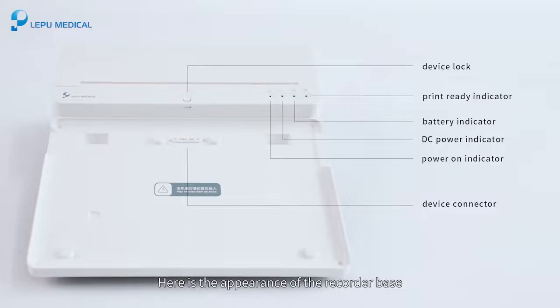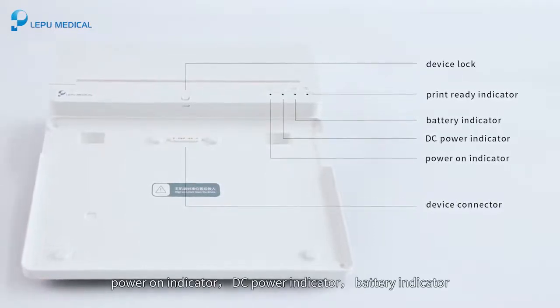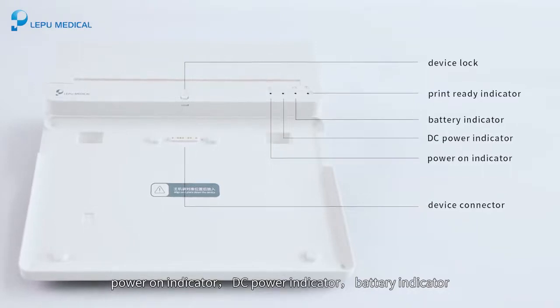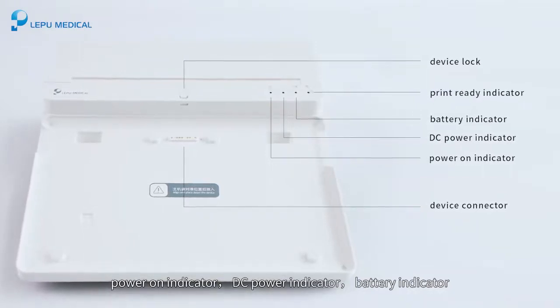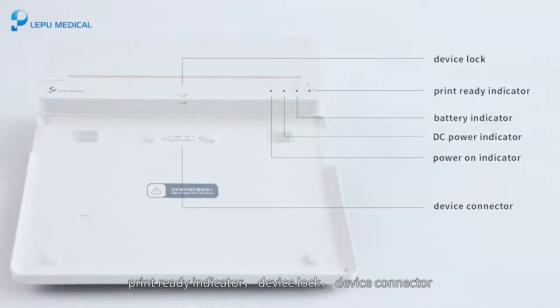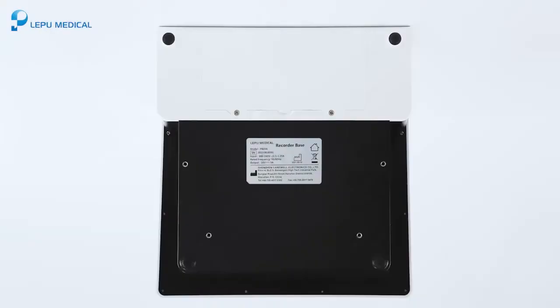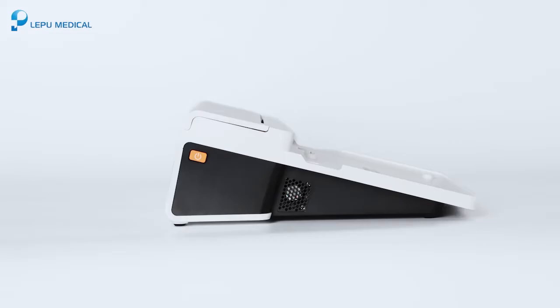Here is the appearance of the recorder base. The front view. Power on indicator. DC power indicator. Battery indicator. Print ready indicator. Device lock. Device connector. Rear view. Battery compartment.